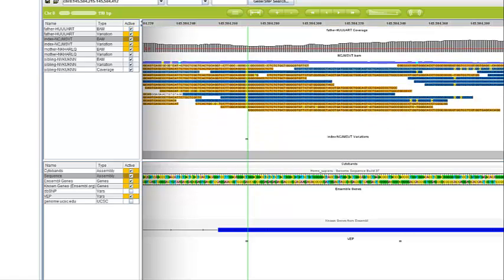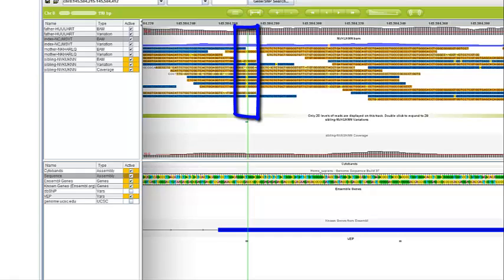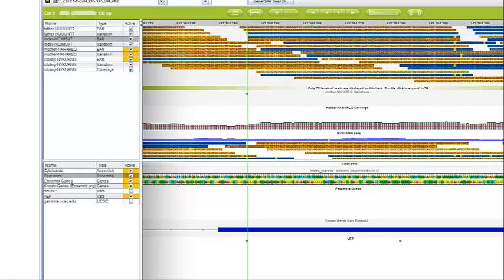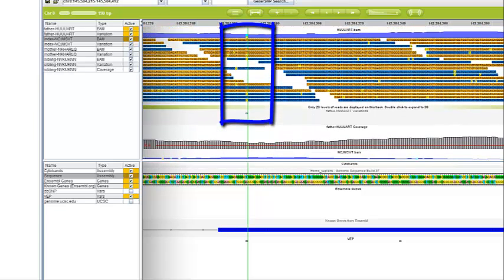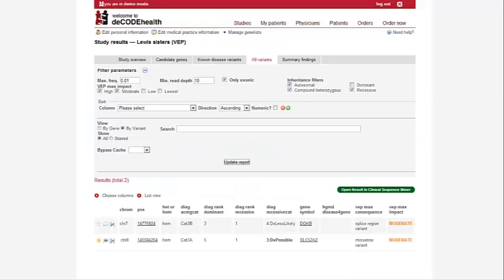Confirm that the index case and her sister are homozygous and that their parents are heterozygous. And establish that the SLC52A2 riboflavin transporter is the disease gene.